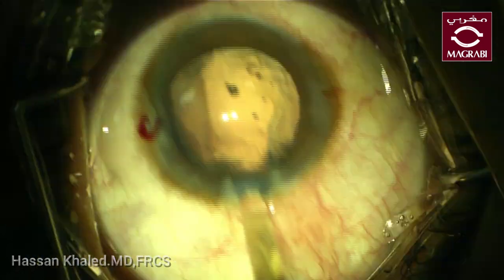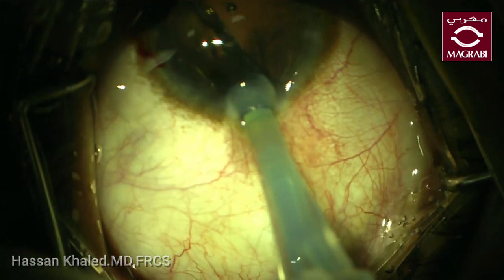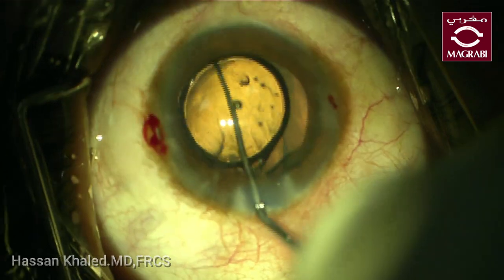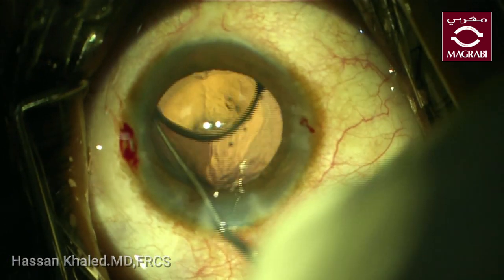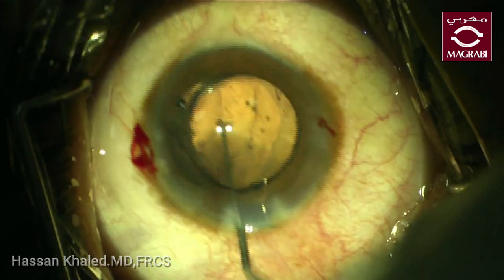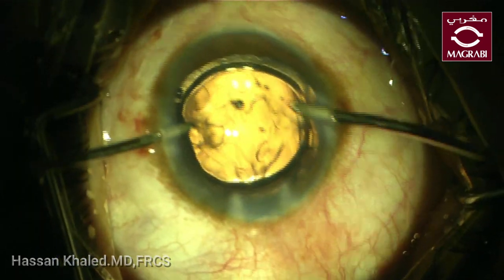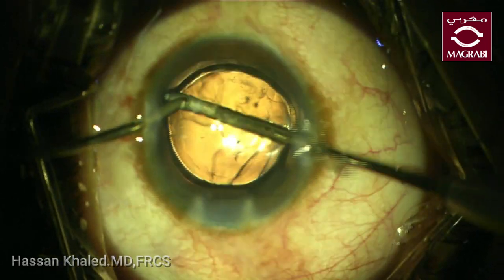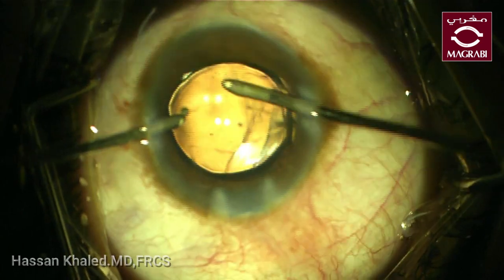Here you can see implanting a single-piece hydrophobic IOL inside the capsular bag, with the haptic adjusted to be perpendicular to the peripheral extension, then using bimanual irrigation-aspiration to remove the viscoelastic from the anterior chamber.